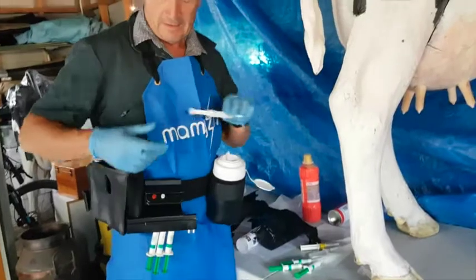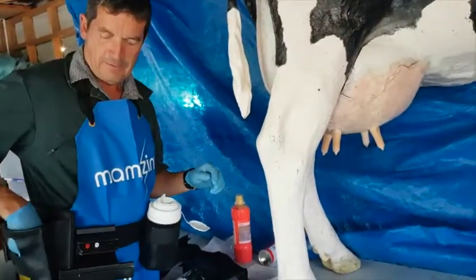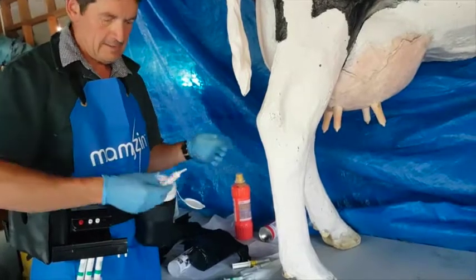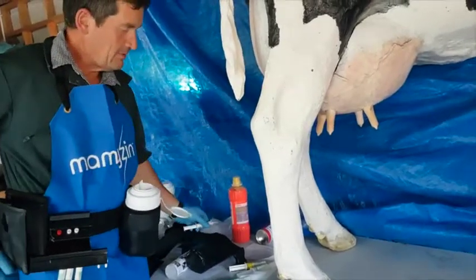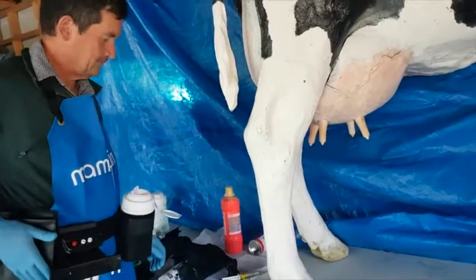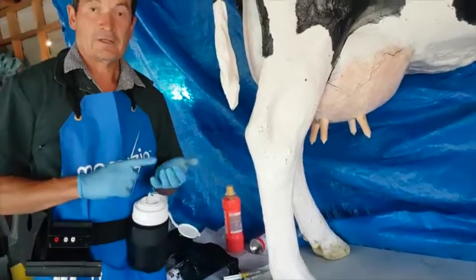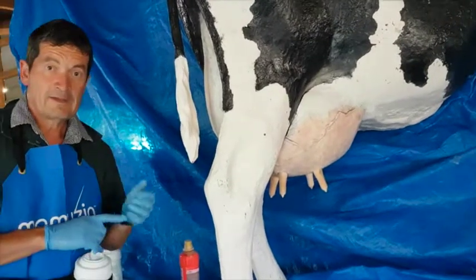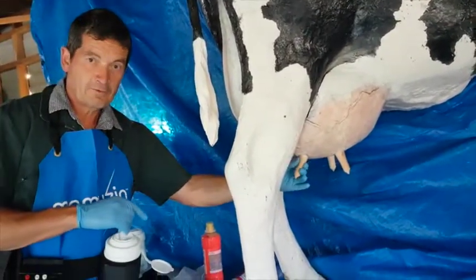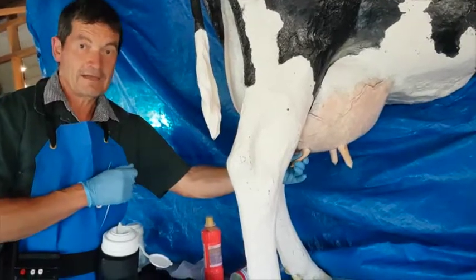During the dry cow process we might keep an antibiotic on our hip — this one a common shape. Easy. We can also keep rubbish, records, and all sorts of other things in this flat pouch. In a nutshell, the system is designed for animal treatment. It keeps things a lot cleaner, and that's very important to prevent infections getting into the cow.